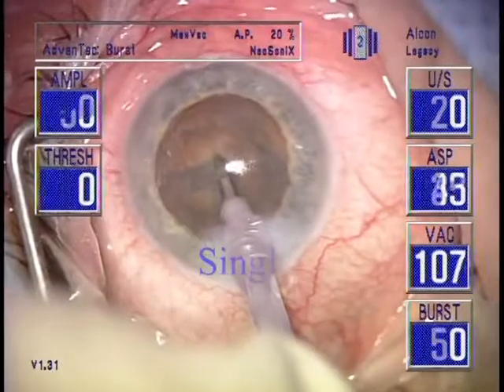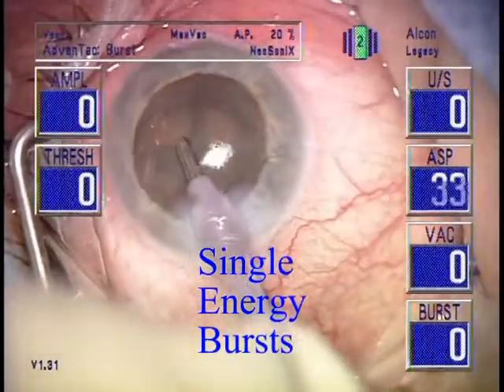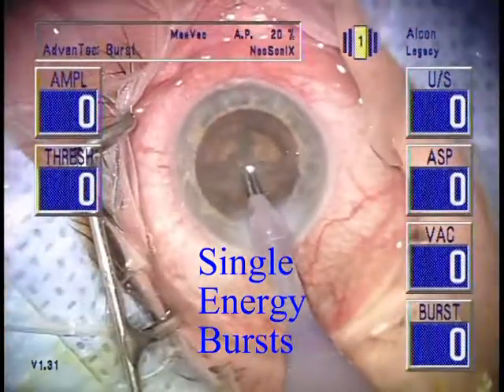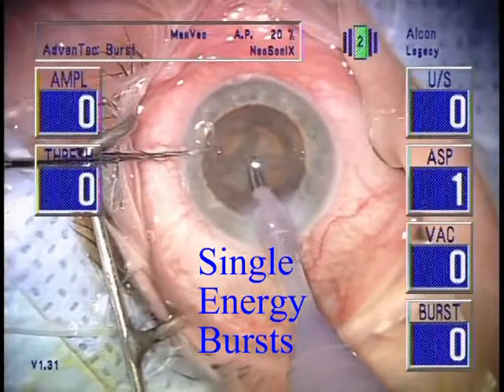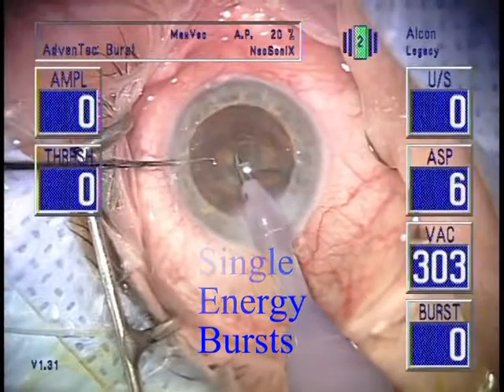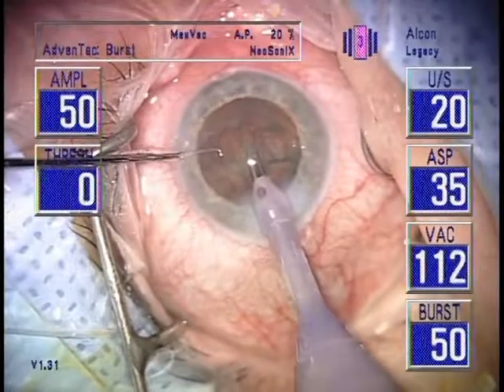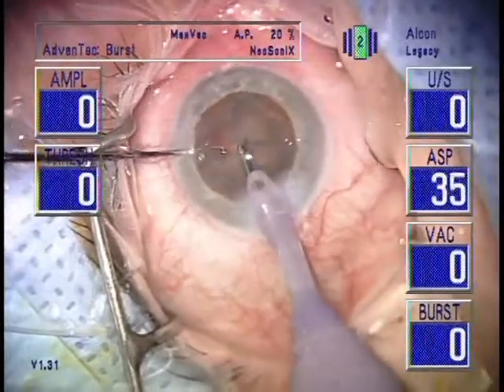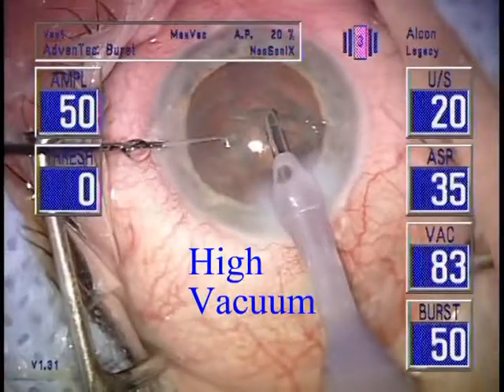Notice how there will be an occasional 20% application of power followed by cutting with high vacuum. I have coined the term 'power bump' to describe this type of power modulation with a single energy burst. The only way to get another application of power is to go back down into foot position 2 and travel back into foot position 3. The only reason to apply power is if vacuum cutting is not working under maximum vacuum.